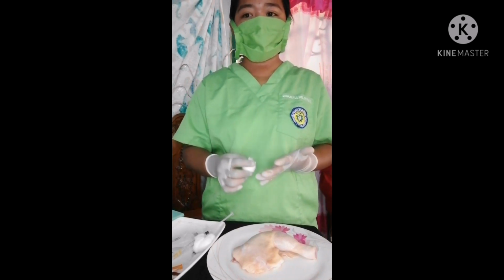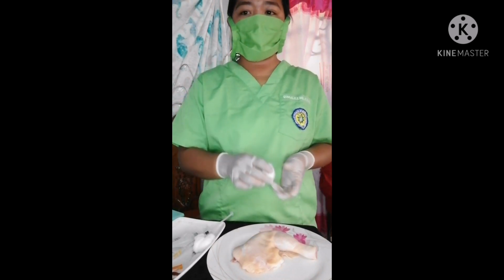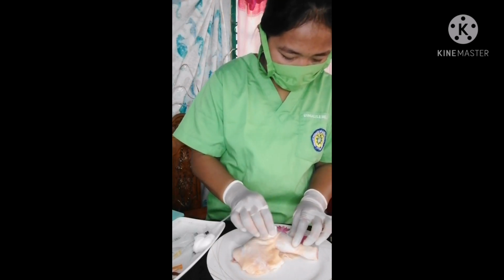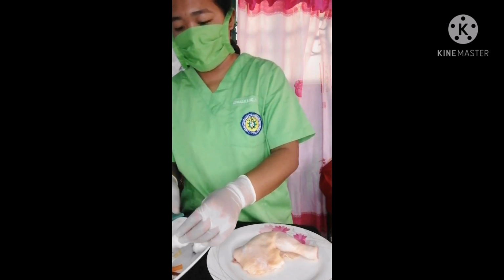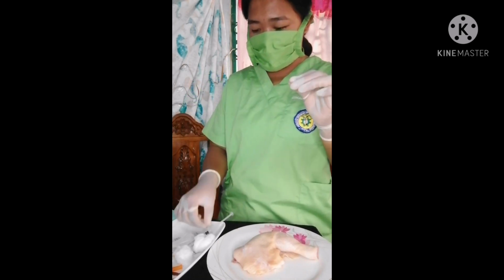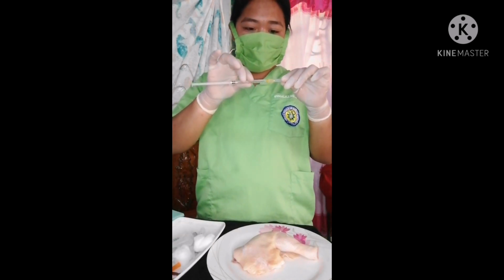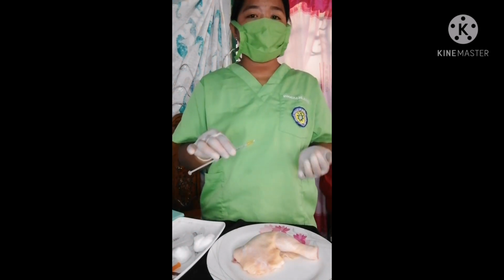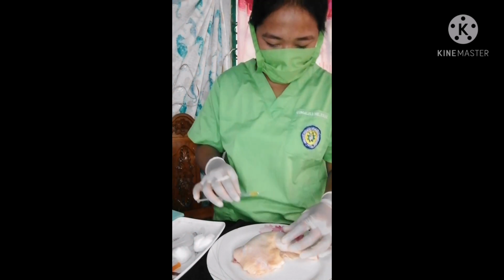Then next, cleanse the site with the antibacterial swab, wiping with friction in a circular motion and moving outward from the injection site. Then allow the skin to dry. Remove the needle cap with the non-dominant hand by pulling it straight off. Then use the non-dominant hand to spread the skin over the injection site.